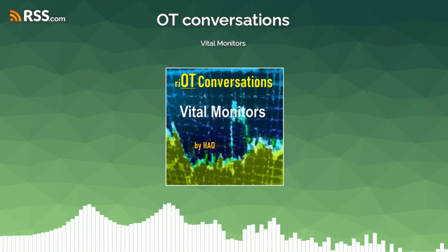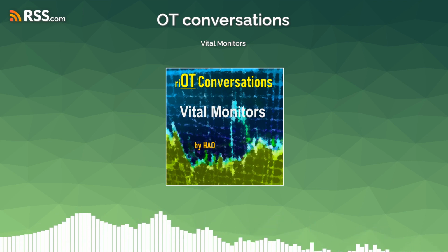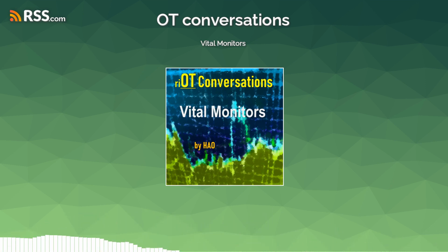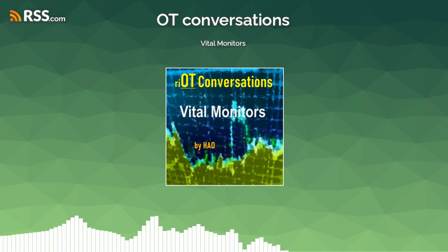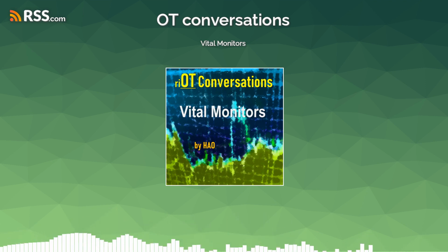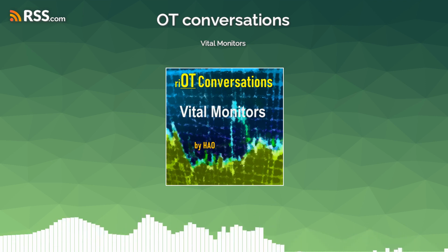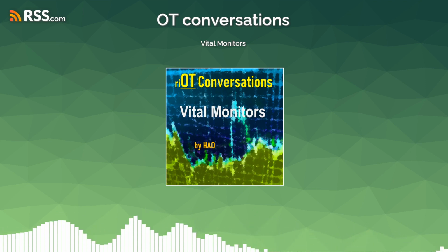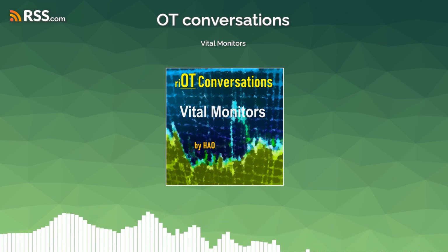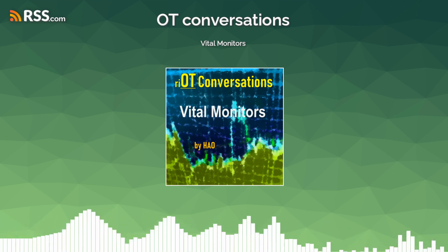The ones that are commonly used in terms of these devices are the subarachnoid screw, and the other one would be the ventricular catheter. Both of these are inserted by drilling through the skull. So whenever you are going to do some physical activities with a patient, it should be limited when these devices are actually in place. You have to be very mindful of this, because any activity that you do on the physical side of things could cause a rapid increase in the intracranial pressure.